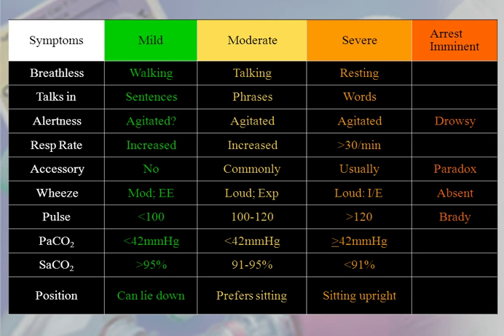For us, the biggest thing is to just be aware. Be aware that the patient, one, can deteriorate quickly. Two, if you find them in that moderate or severe stage, make sure you prepare yourself for an imminent intubation. Secure that airway, control it.